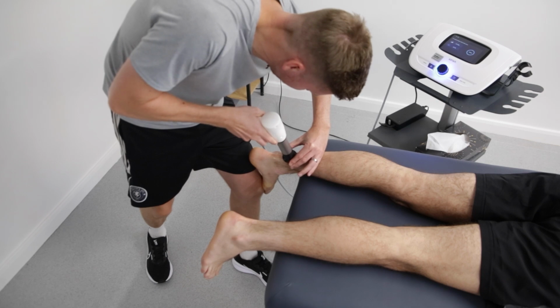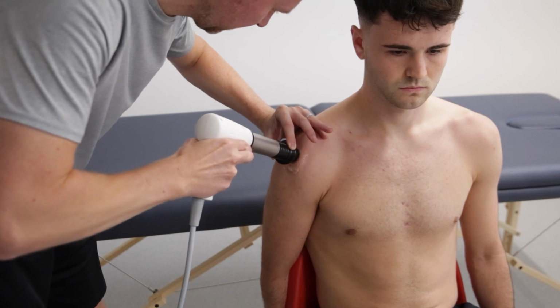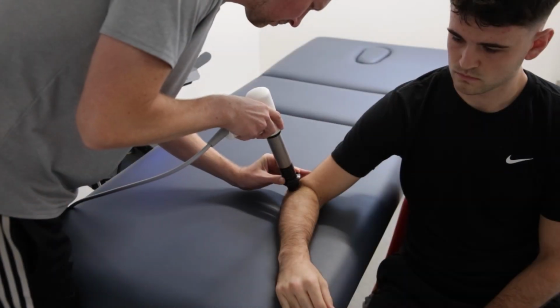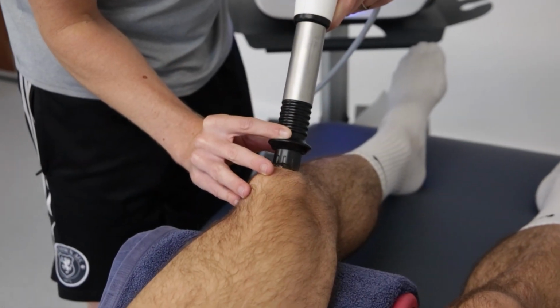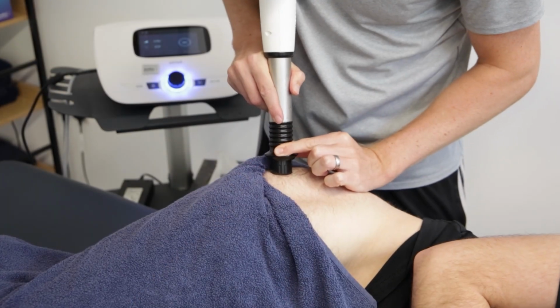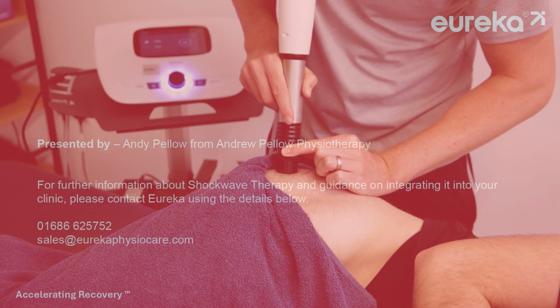So from that initial overview of radial shockwave therapy, we can appreciate that it is a quick, relatively low risk, non-invasive treatment modality that helps the body heal by producing acoustic waves that produce biological effects in the targeted tissue. When compared to focused shockwave therapy, radial shockwaves are broad, superficial, and of lower intensity. Therefore, radial shockwave therapy is indicated for the treatment of soft tissue and tendons near the surface.